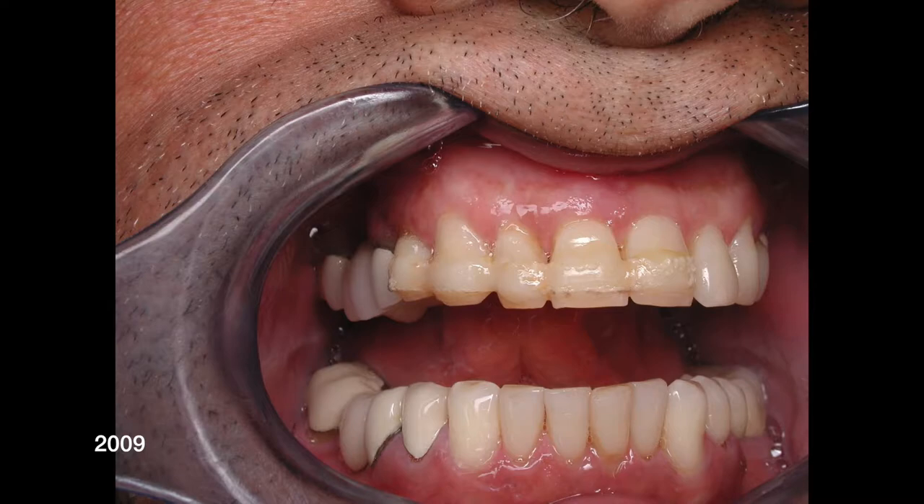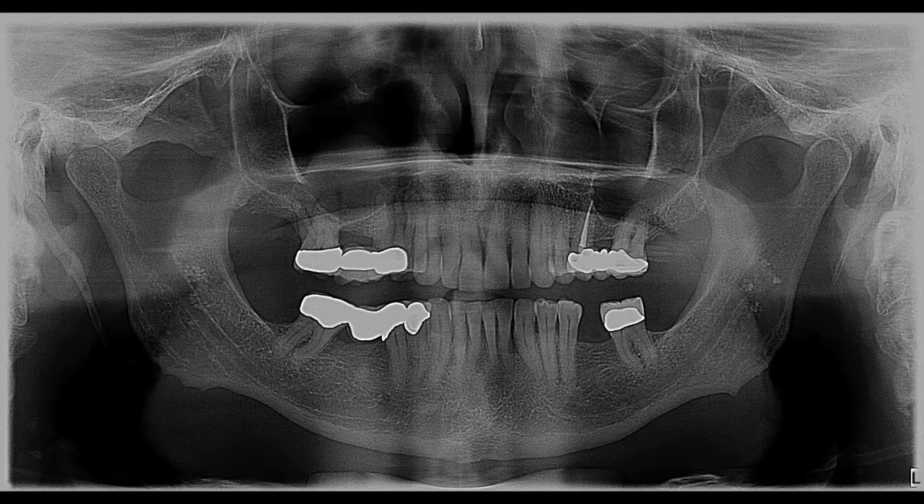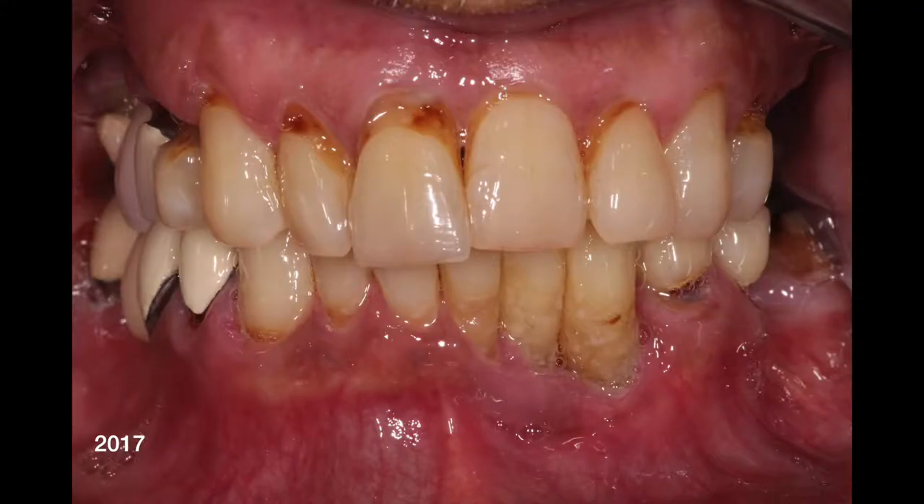Here we are in 2009 again, looks very similar to 2008. In 2013, he still has the three bridges, things are still there. Looks very similar to what he looked like five years previous. And then some years have gone by, and in 2017 he shows up in our office and now we see this — we can see a great amount of bone loss around those lower front teeth.